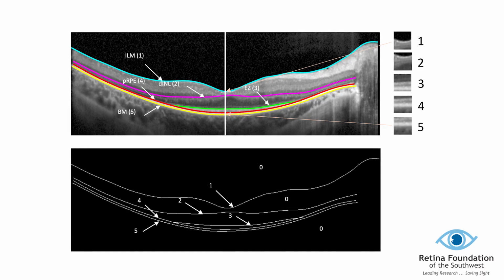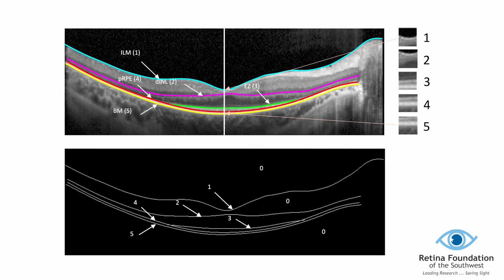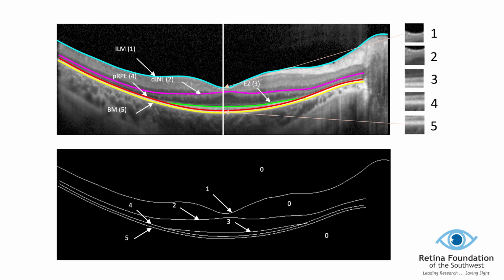We employed a deep machine learning model designed to process small image patches. To apply this model to process OCT images of RP patients, each OCT image needs to be divided into many small patches. The patches are labeled based on where they are in the OCT image. In this way, millions of labeled patches can be generated for the model training and testing.